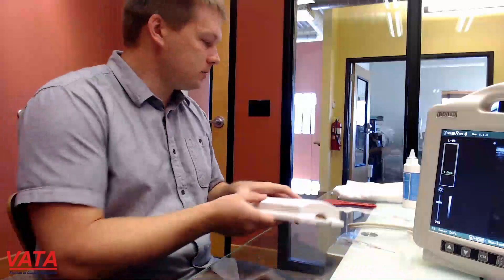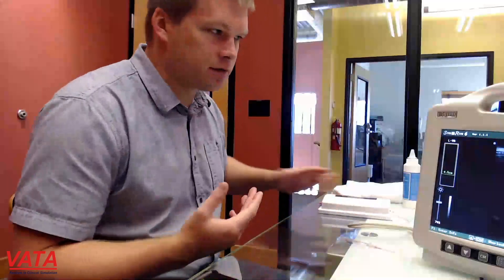It should work with all different ultrasound machines. We tried it with numerous different machines from different companies and it has worked just fine with all of them. The gain on this one — you don't have to adjust it super high like some other models out there. You should be able to use it with a more normal gain. We have the gain on this machine at 70% today, and normally I actually use a little bit lower, but for video it shows up a little bit better.